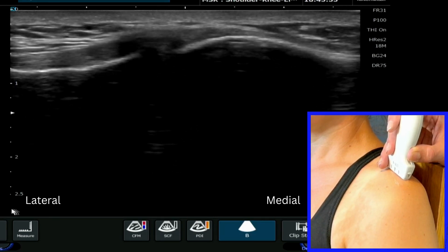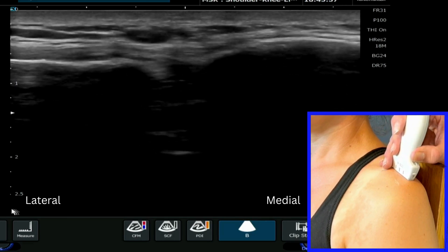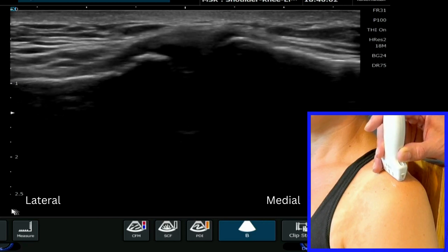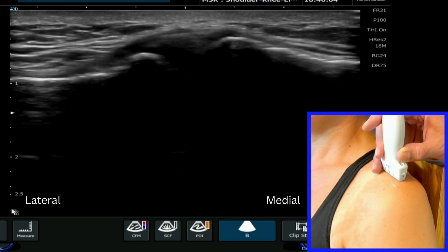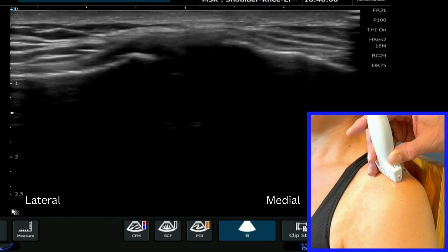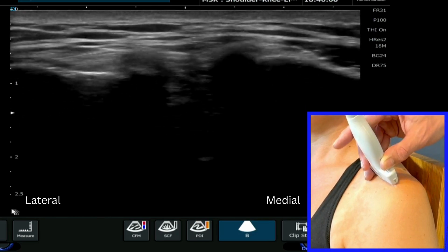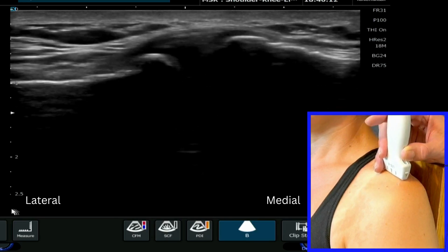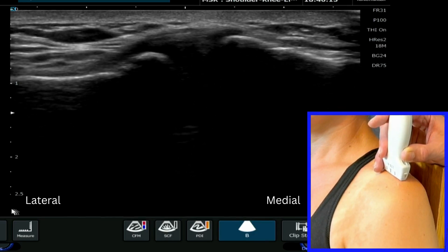You can then move all the way through to the posterior aspect and then come all the way back through over the most superficial aspect on top of the shoulder and into the anterior recess as well, more anteriorly. That is how you find the AC joint on ultrasound.